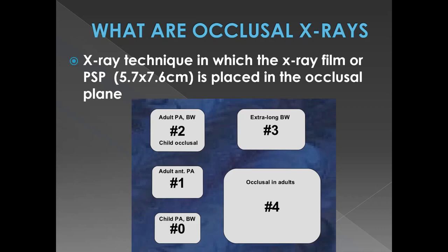You don't have to dispose of it. It's not like there is a separate film for every patient. You wrap this PSP film in an X-ray sleeve or cling film, so you can reuse it on a different patient. It has its own machine which interprets the X-ray, and you just connect that to your laptop, and that gives you the image that you want to see.